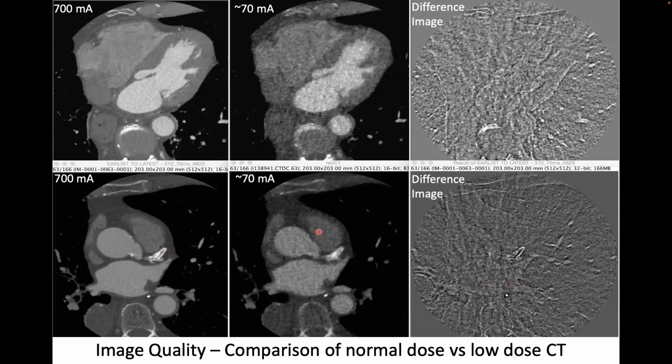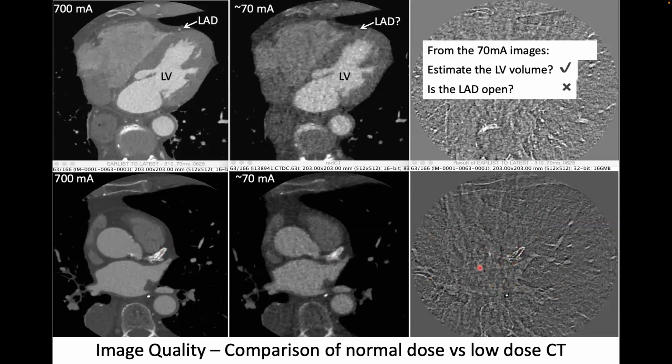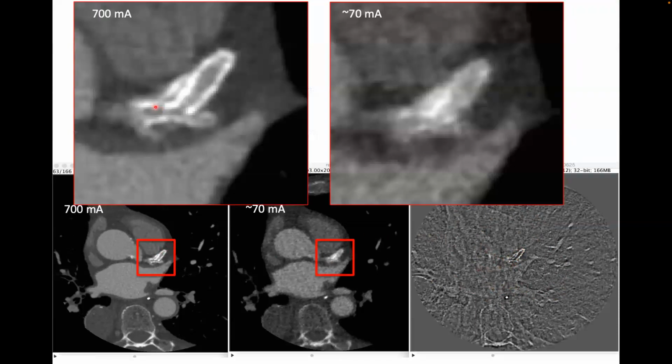Specifically for things that have really sharp edges, there's a big difference, right? So it's just a smooth picture. So there's the difference. The details go away, right? So it's not just a signal to noise thing.